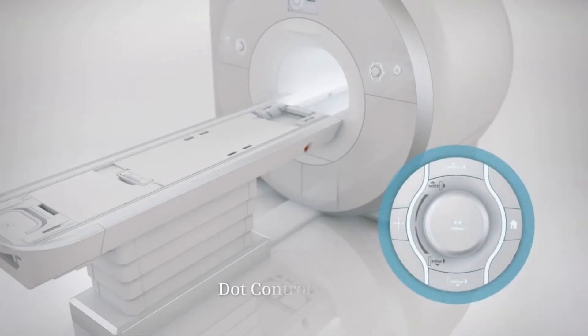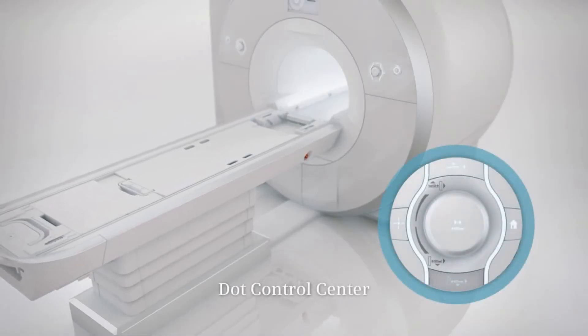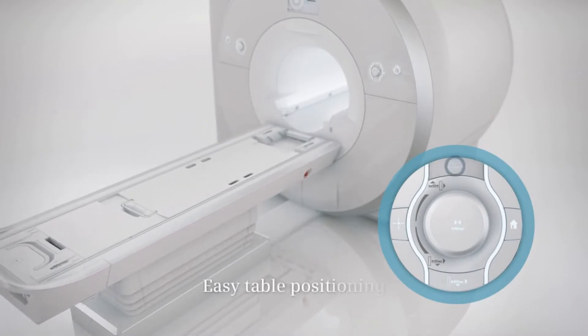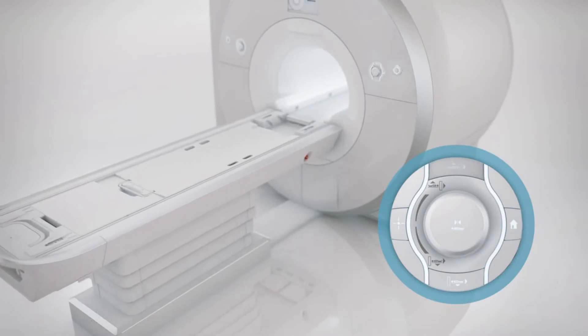The Dot Control Center allows easy and fast patient setup. The table can be easily positioned by the touch of a button.